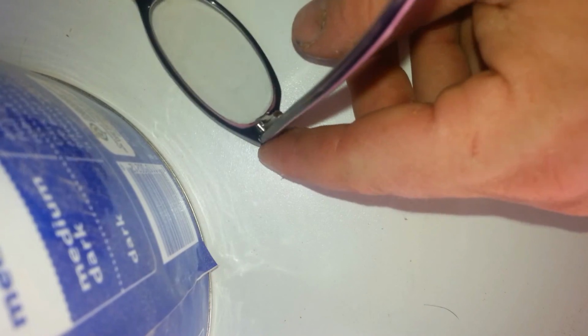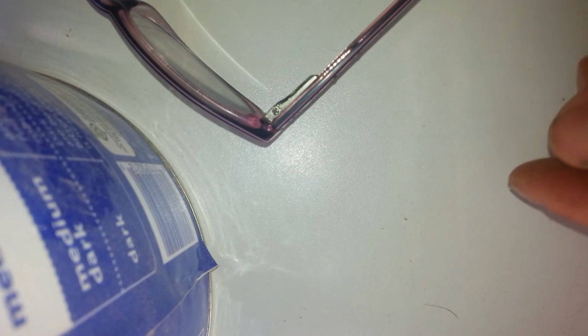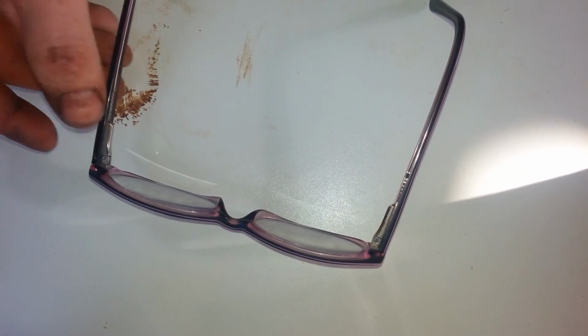So, I hope this helps somebody. As you can see, it's nice and tight. And we just let it cool off and put it back in use.